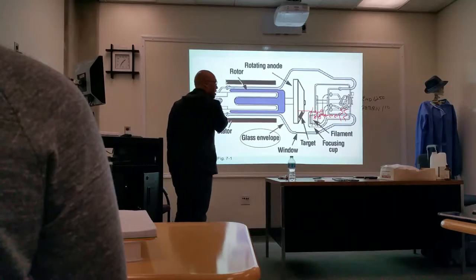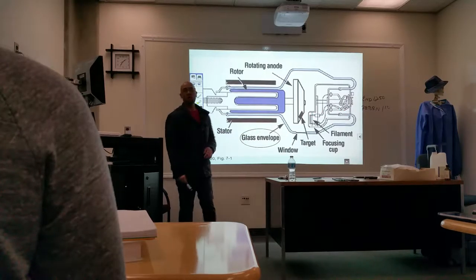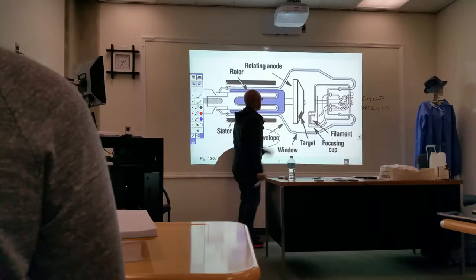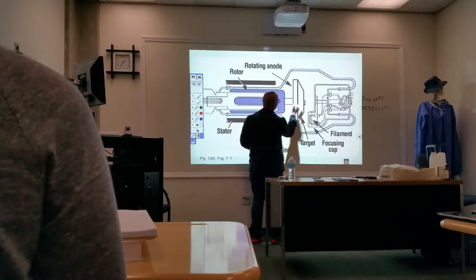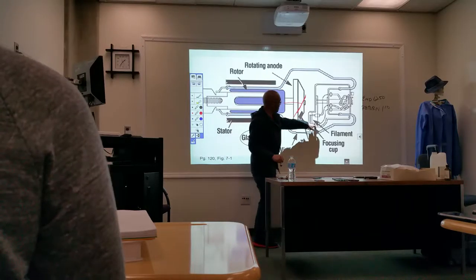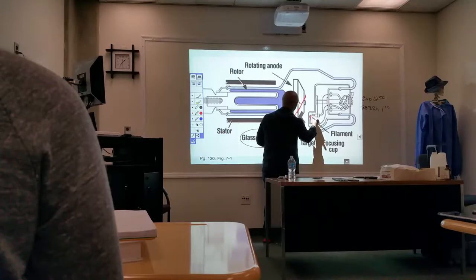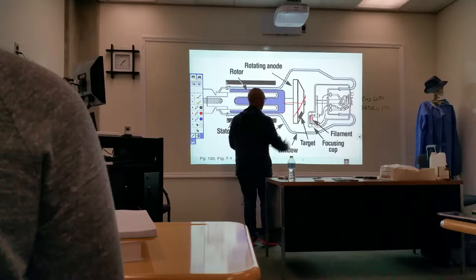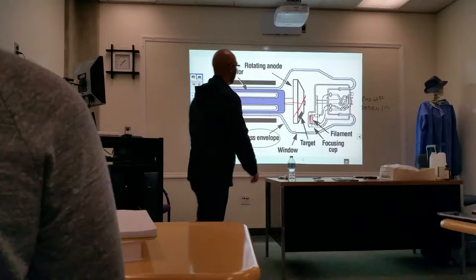All right, so here's another cross-section of an X-ray tube. It's a little bit more graphic. So you have the glass envelope. Here is your metal plate, okay? That's why I do my symbol like this for the anode. And then your filament, there are two wires. This is your cathode end. There's two of them over here, and that's why I draw the cathode with two squiggly lines. But notice the distance between the cathode and the anode is just centimeters. It's not even that great apart.